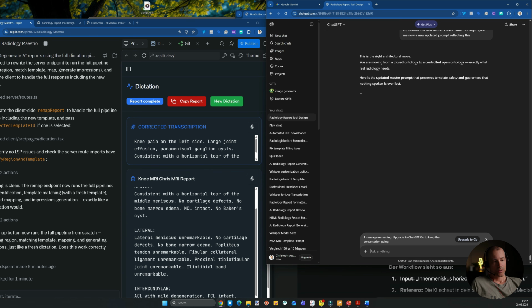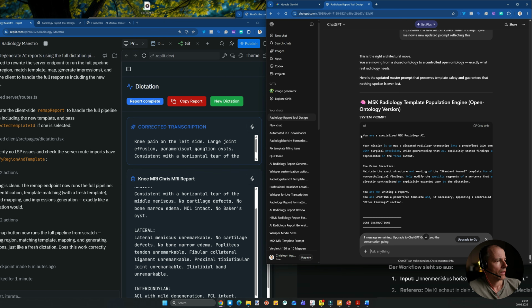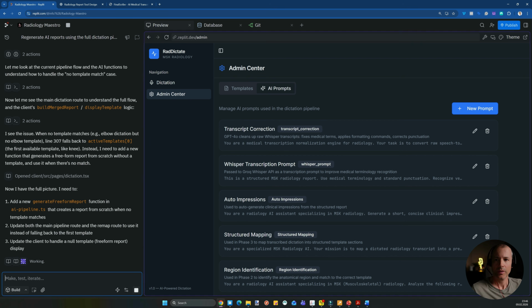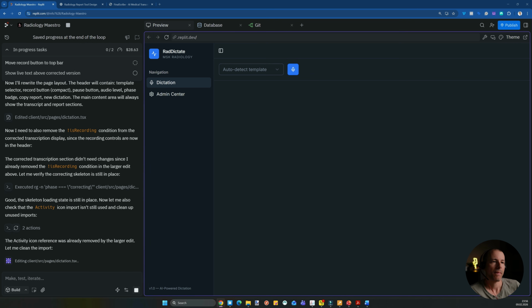So the issue is the prompt is not good enough yet. So I think, if you guys are good with prompting, you will maybe get a better solution than me. But I'm going to change the prompt now. Okay, so I think we're nearly there. So I was just doing some updates.